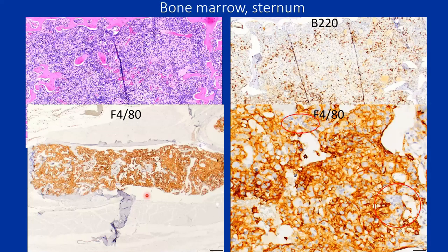This particular case also had mixed cells in the bone marrow and sternum — you can see histiocytic cells and areas where they're less dense. F480 makes it look like it's filled with F480-positive cells, but B220 staining reveals they're present. By high mag you could also differentiate that they are the abnormal neoplastic B-cells, not just resident B-cells. F480 does see scattered non-labeling cells, but it's definitely overpowering the non-histiocyte cells.